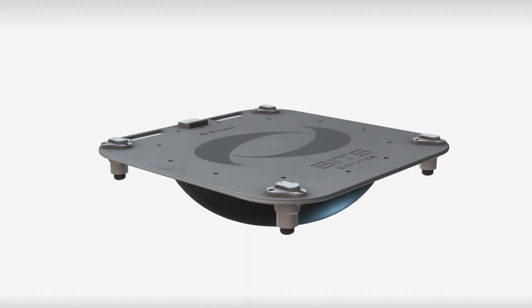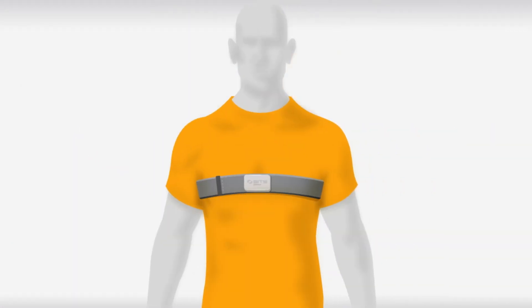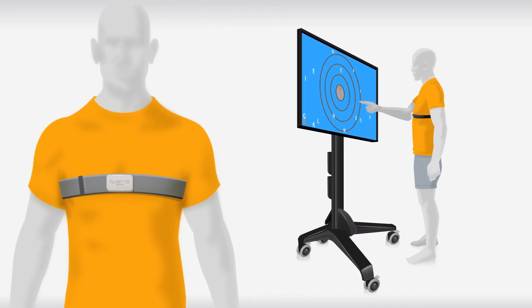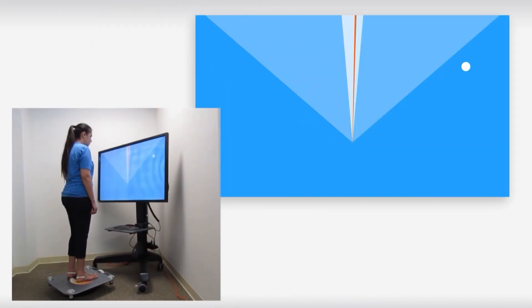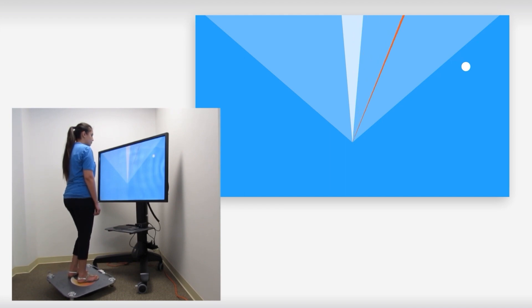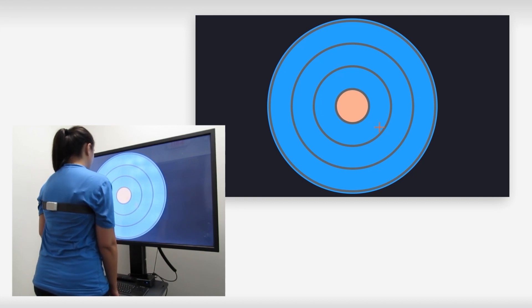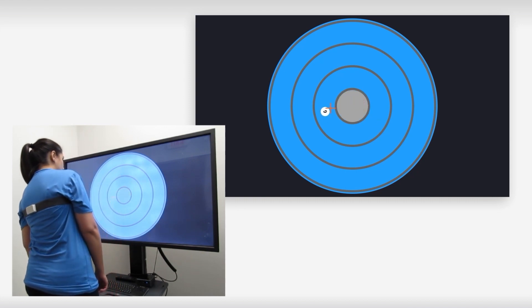Utilize the BITS Balance Platform and Motion Sensor Technology to challenge overall balance, stability, and strength. Track patient's posterior, anterior, and lateral movements during balance exercises to challenge both static and dynamic balance control.